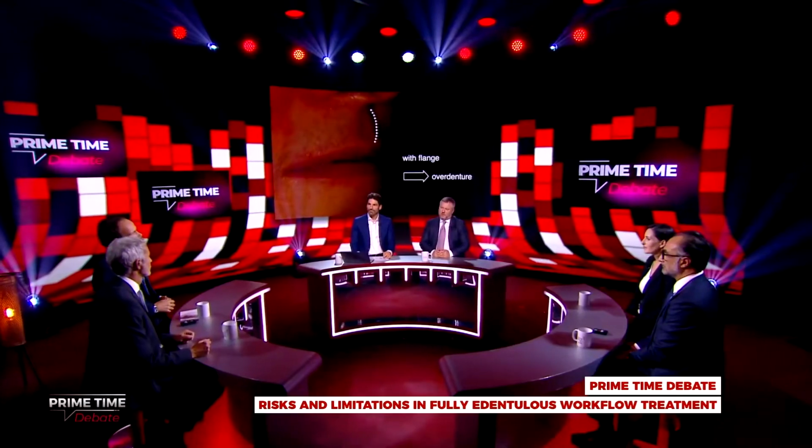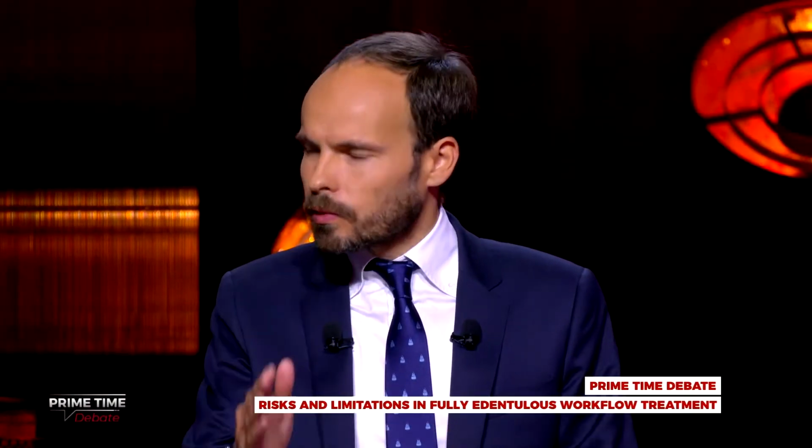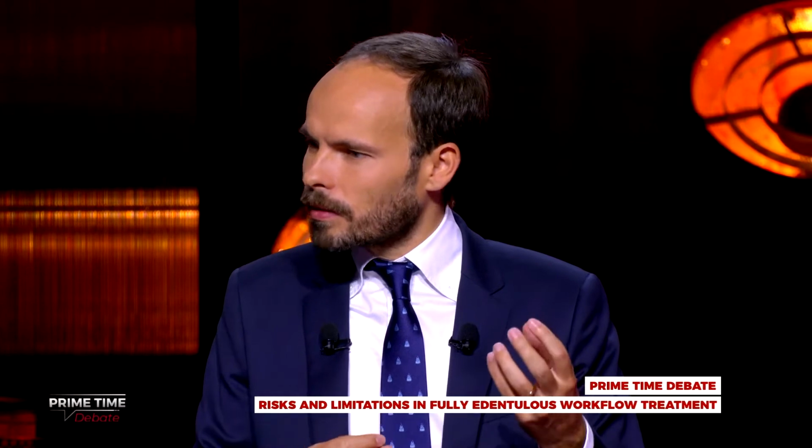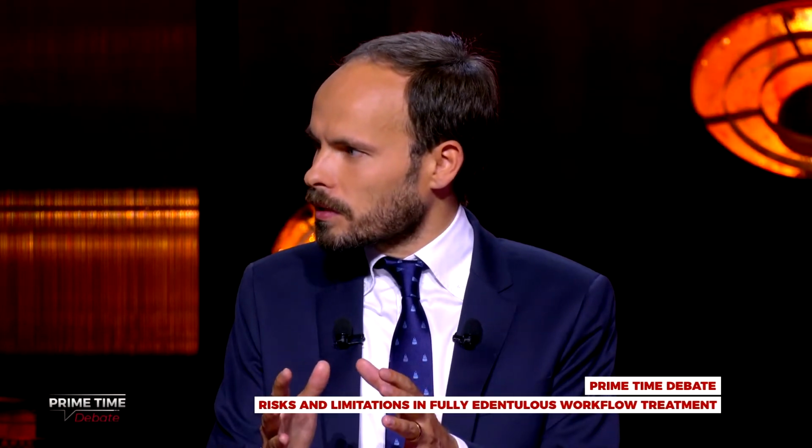I think this is maybe, sorry Bjarni, one of the critical parts to address here. Going straight for a printed mock-up seems very appealing in a digital approach, but on the other hand, it makes you very static once actually entering the clinical scenario. Yes, you can remove the flange, you can also grind it off, but then you're static with your teeth. However, in your traditional setup, you will be able to play intraorally with the teeth just like we have learned it. So this is a huge advantage, actually contradicting this digital workflow.